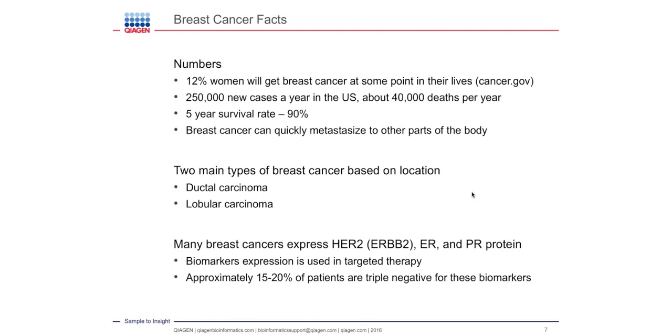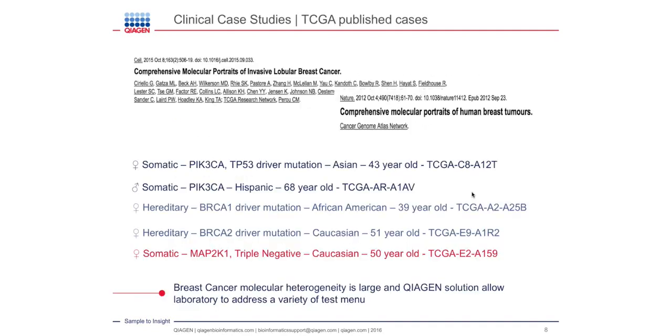Taking all of that into account, we decided to select 5 different case studies that allow you to see the breadth of information and knowledge, and how QCI can really allow you to have a test menu that will focus on all the different etiologies of breast cancer.